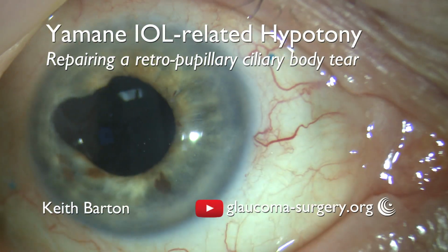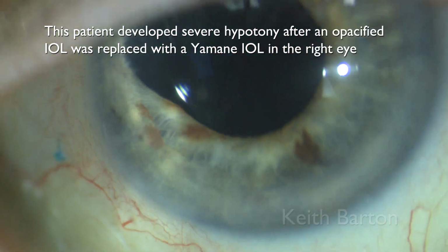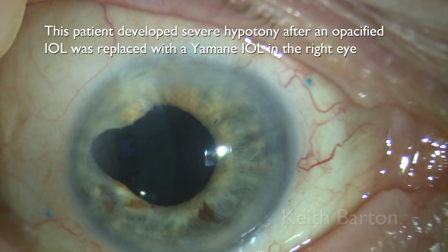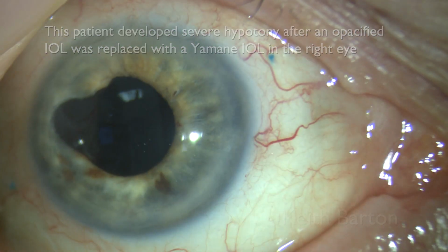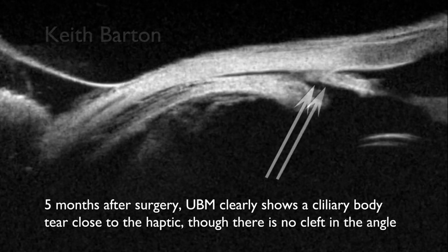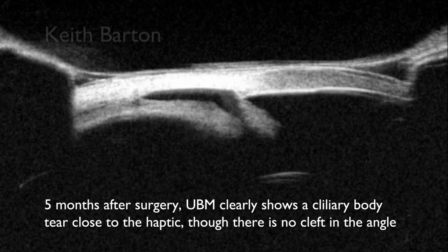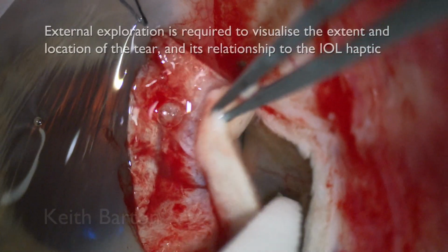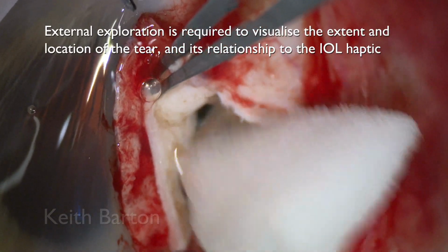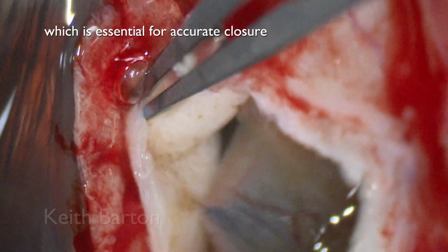Hi, I'd like to share another interesting case of hypotony. This patient developed severe hypotony after an opacified intraocular lens was replaced with a Yamane-fixated style intraocular lens in the right eye. 5 months after surgery, UBM clearly shows a ciliary body tear close to the haptic, though there is no cleft in the angle. External exploration is required to visualize the extent and location of the tear and its relationship to the IOL haptic, which is essential for accurate closure.